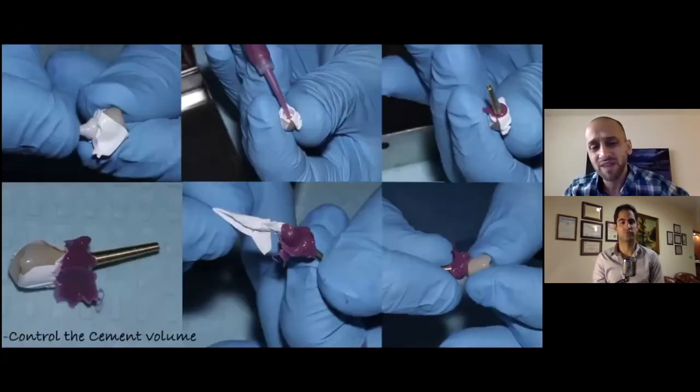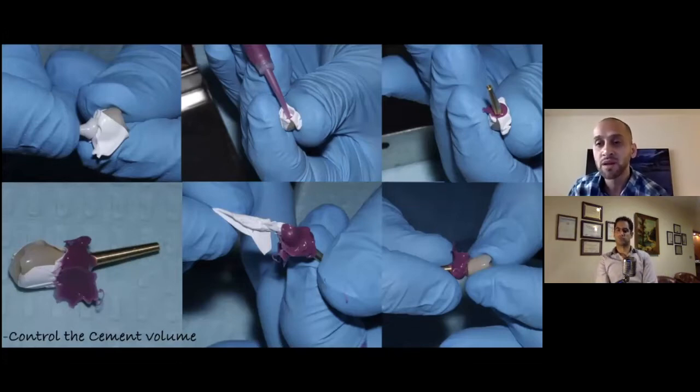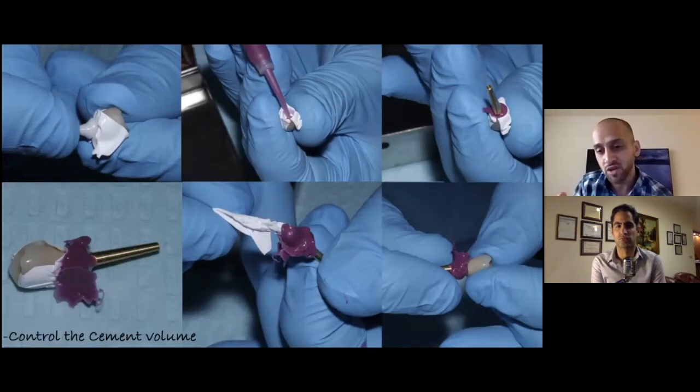Some people have talked about cement protocols where you take your abutment, you apply a little bit of Teflon to simulate the thickness of the cement, you push that into the crown, you remove the crown. Now there's an imprint of the abutment inside of your crown. You fill that with polyvinyl siloxane, any type of PVS, could be medium or heavy body. You take a dowel pin, this could be a paper clip. You push that in there, remove it. Now you have an impression of how the abutment looks.